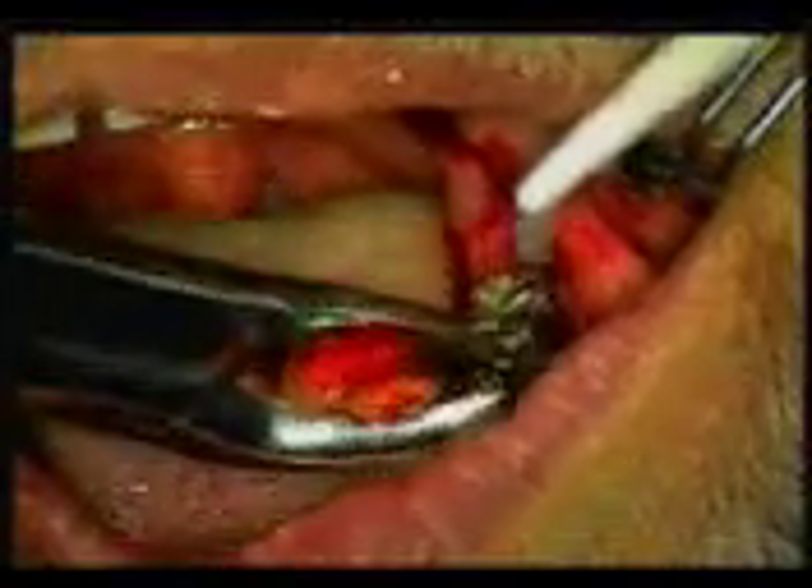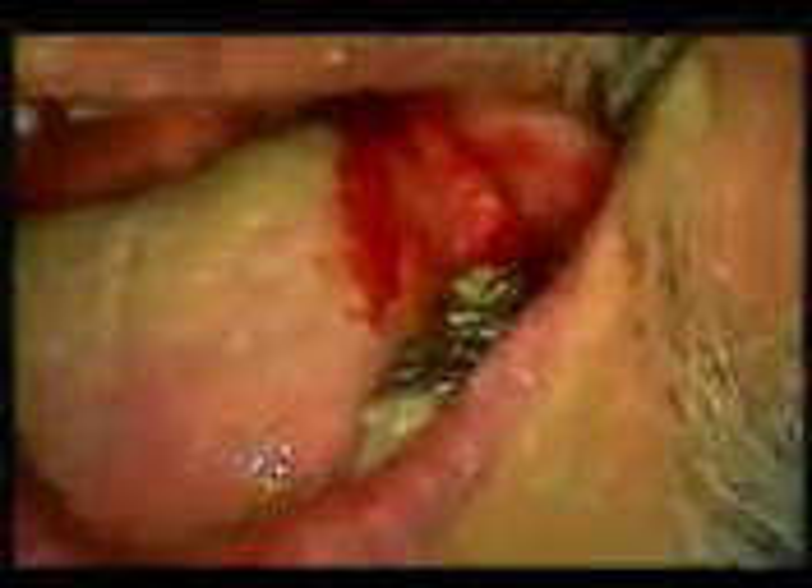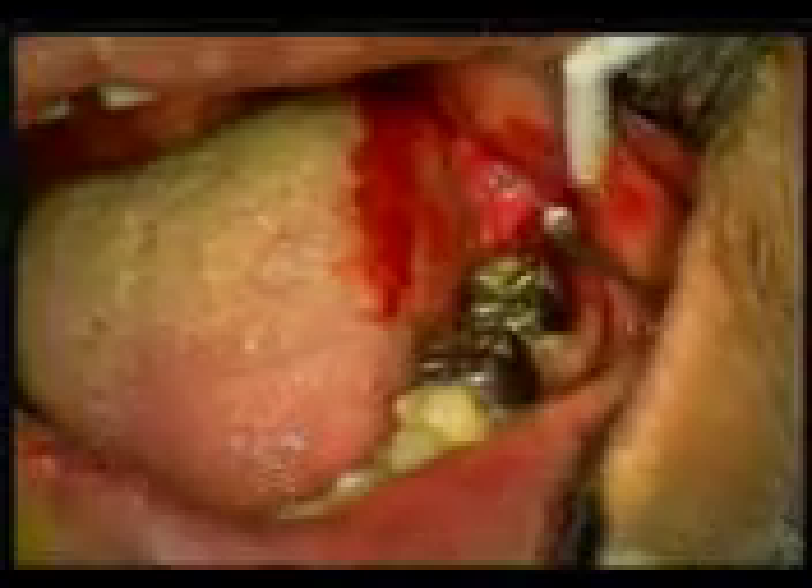I'm two minutes into this whole process. I'm not overly concerned about doing something in five seconds or ten seconds. I want to make sure that when everything's all said and done, I've been as atraumatic as possible and I'm not having to go back and repair a bunch of stuff that I boogered up during the course of the extraction.